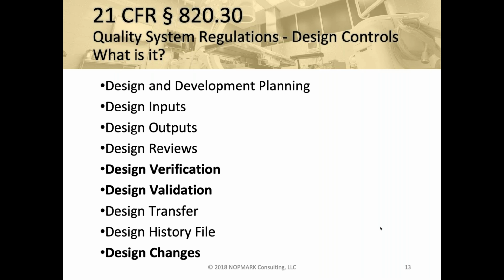So verification there is, do we meet our software requirements? Do we meet our user requirements from a software perspective? The validation gets to, does the software do what the user needs it to do? So when we're looking at clinical claims, medical claims for our software, can the customer use the software to achieve those goals?